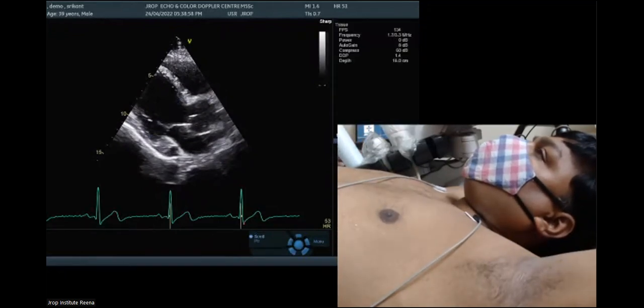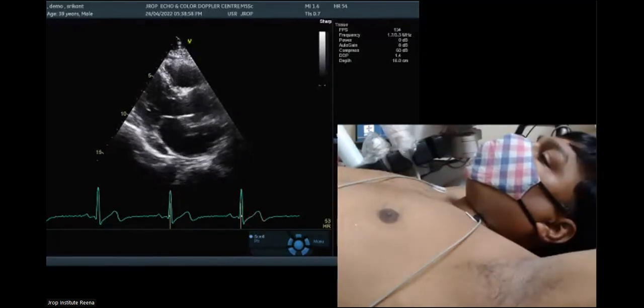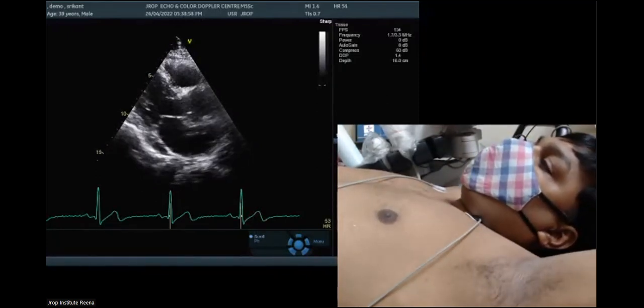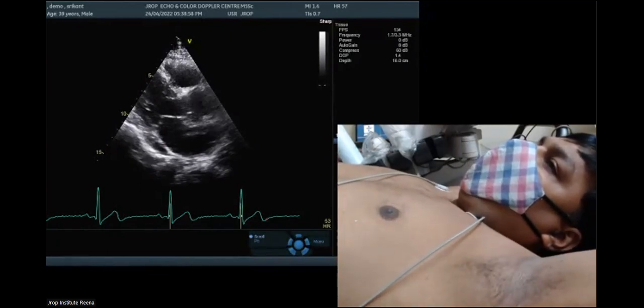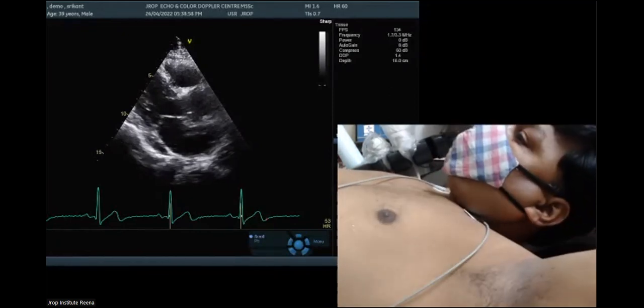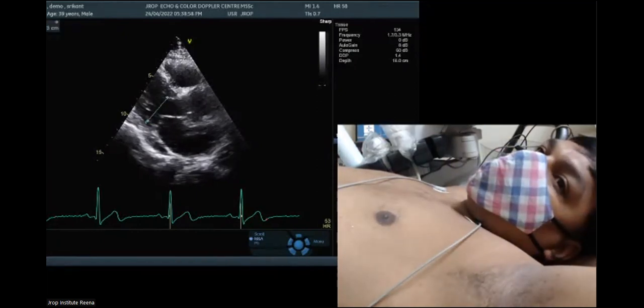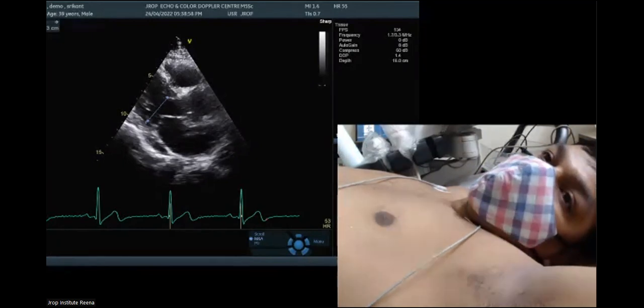Similarly, this is diastolic. Now we scroll the patient to systole. It should reduce by approximately one third of its size. That was 50, and now we measure it again. This point to this point is almost 33. So truly speaking, 17 to 33 is 51. So 33% reduction of LV contraction, which is very carefully seen.